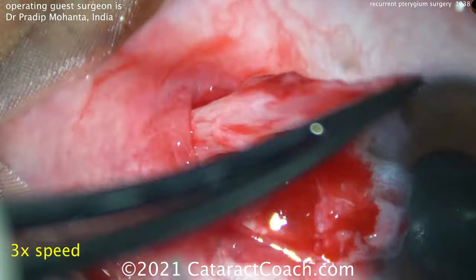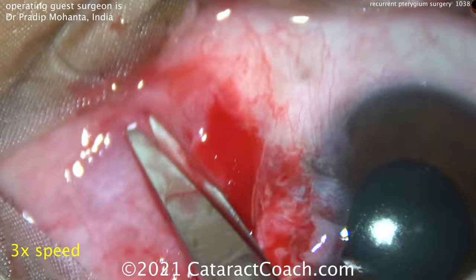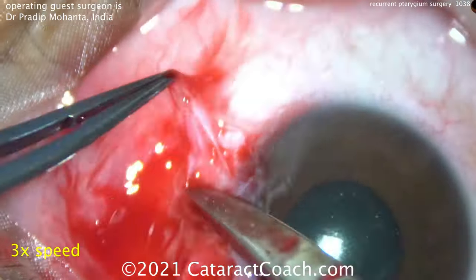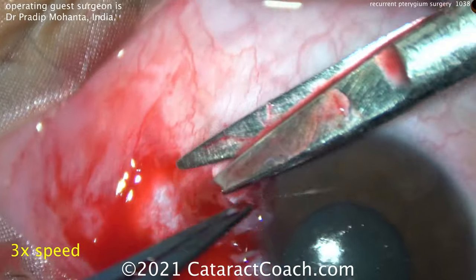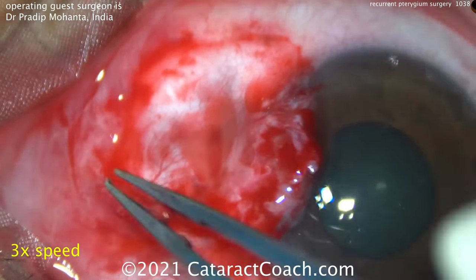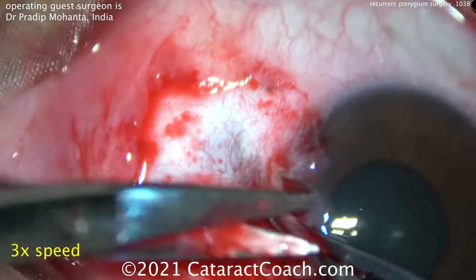There's all this prior scarring from the prior surgery. You see a big mountain of the pterygium — the Tenon's layer — and you're trying to get to the base of it. That's a pretty good dissection. Notice: no cautery, no cautery at all. A little bit more dissection here, and you can see that conjunctival opening is going to enlarge as more of this Tenon's is carefully dissected off. The goal is to get down to bare sclera and dissect off this Tenon's layer of the pterygium.